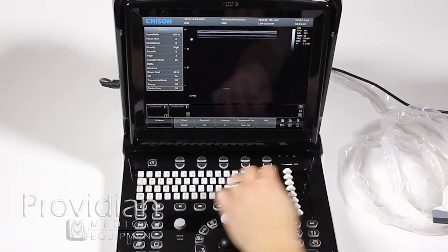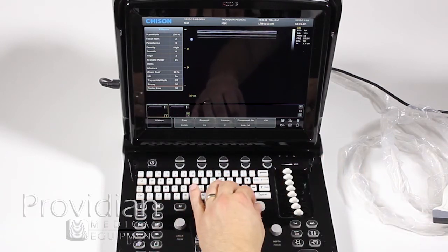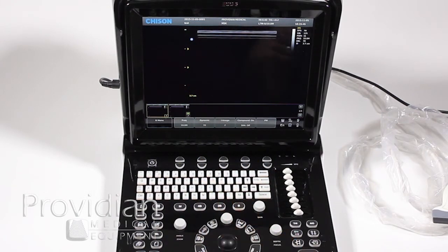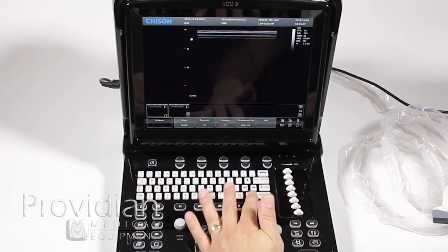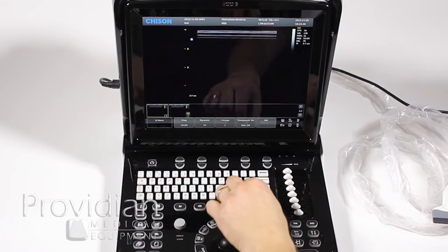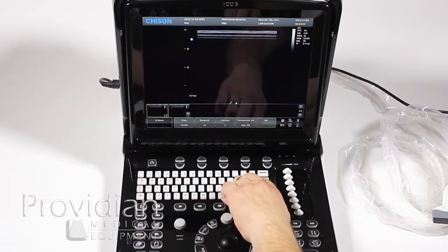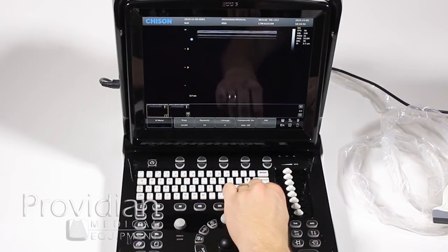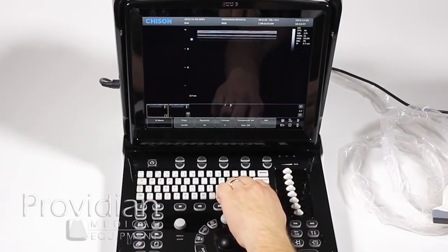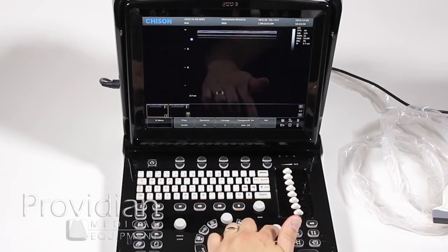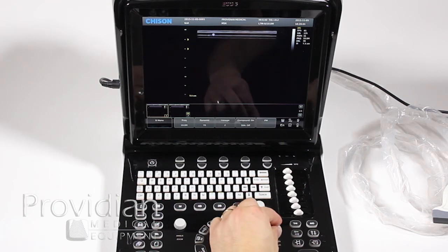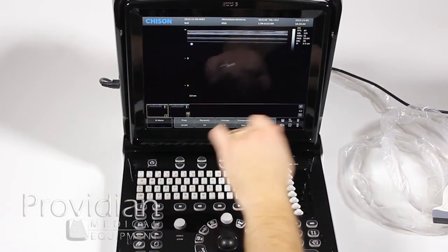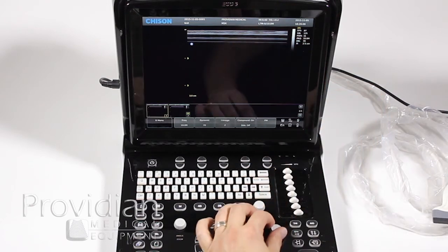Up here we have our gain control. If you've used other ultrasound machines, the gain is typically located here or here — in this case it's up here, though that may change someday. Note that's the gain control, and your depth control is here as well. You'll see the depth adjusted, and it will also show your depth on the image.